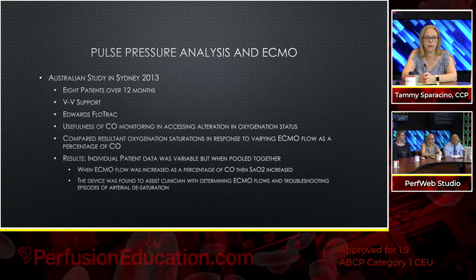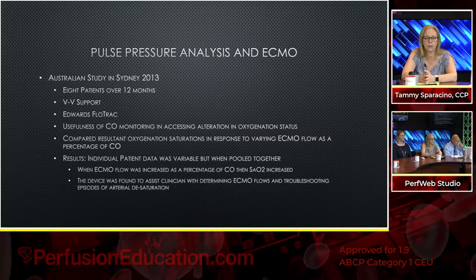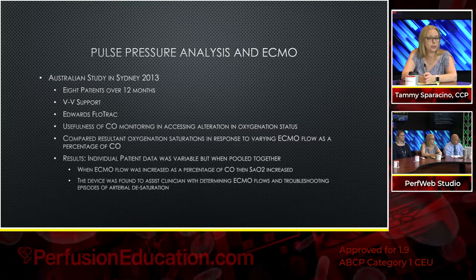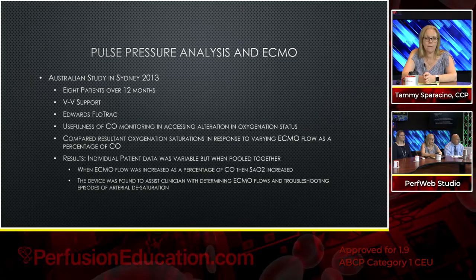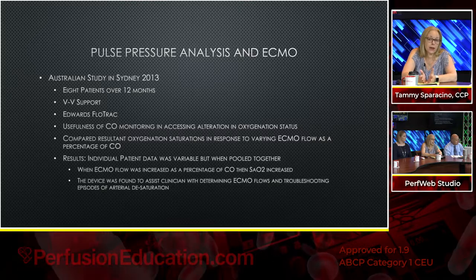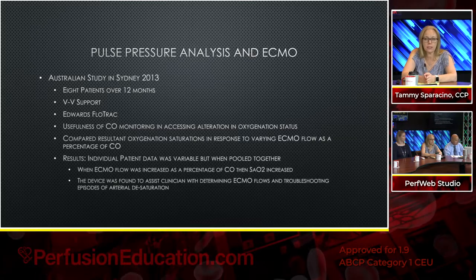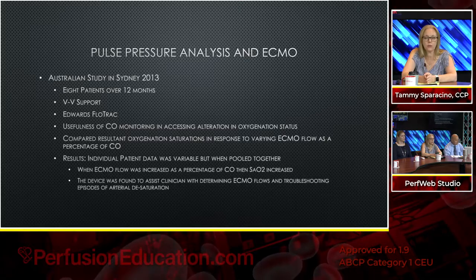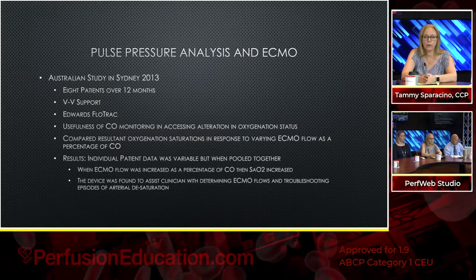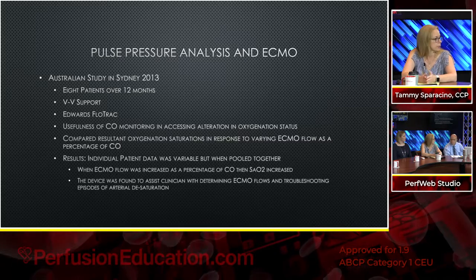When the ECMO flow was increased as a percentage of the cardiac index, cardiac output, the arterial saturations did increase. With this device, right. And they found the device to be useful and to assist the clinician in determining when ECMO flows needed to go up and when they were just troubleshooting minor episodes of arterial desaturation.